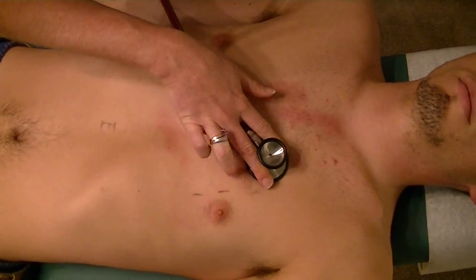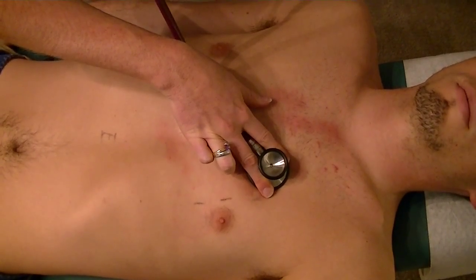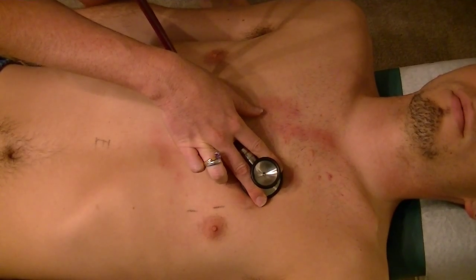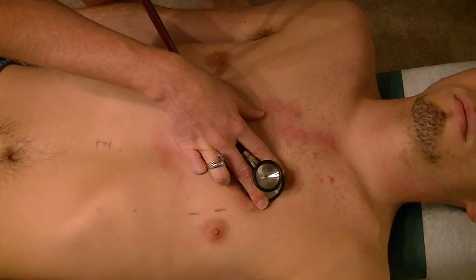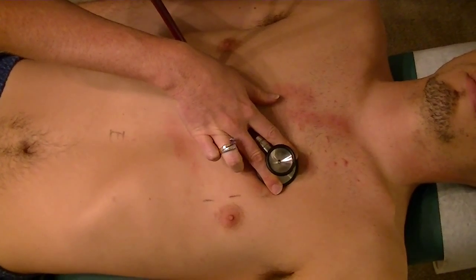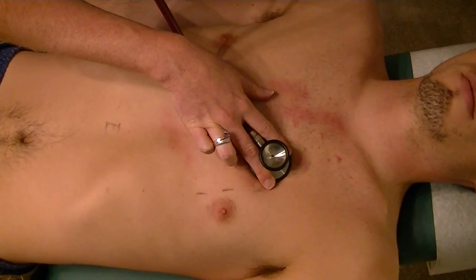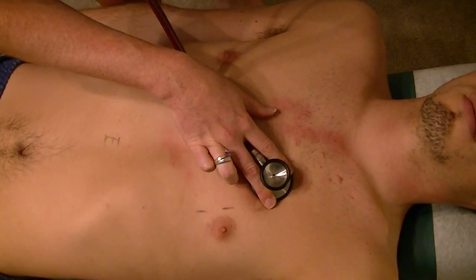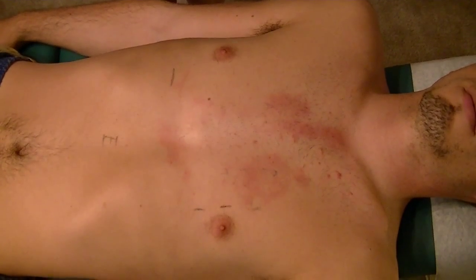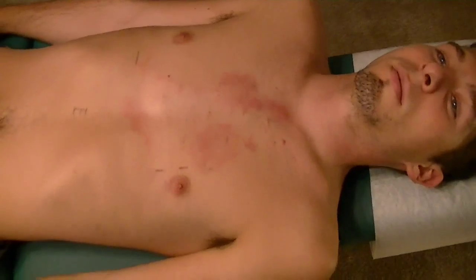You go up to the pulmonic area. You continue to use the diaphragm listening for S2. State that S2 is best heard at this point, and then you stay at this point and you say that you're listening for diastole, stating that you're listening to see if S2 is accentuated or diminished, and that you'll be listening for the splitting of S2. Then you move on and you have the patient assume a lateral recumbent position as we're listening for a murmur.